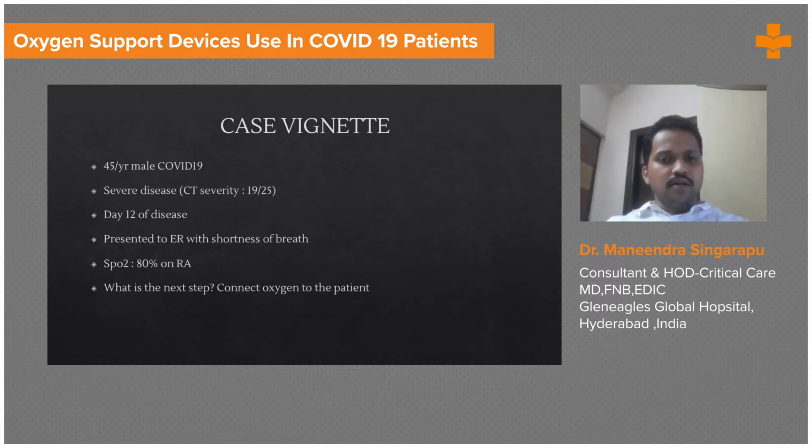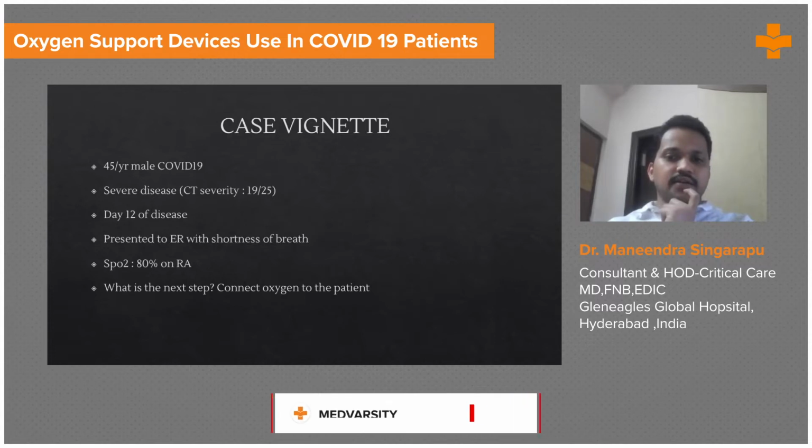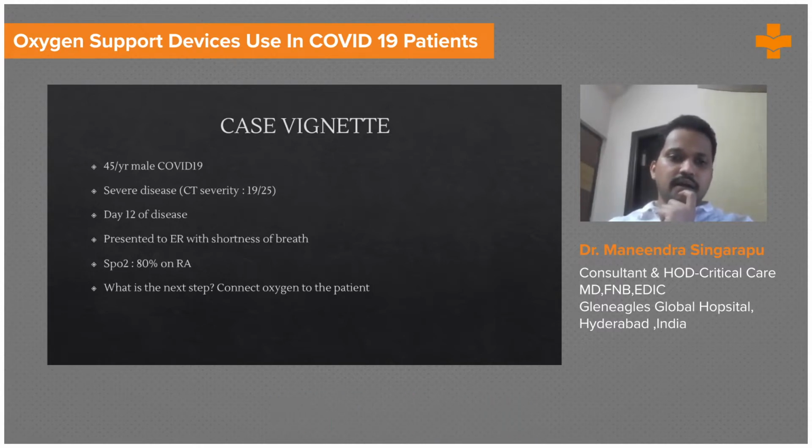So I'll be talking about two such interfaces. One is HFNC and the other is NIV. NIV here, in all my presentation, will be a portable NIV and not an NIV on the invasive ventilator. Even on the invasive ventilators, you can use them either in a non-invasive mode or an invasive mode. But here I am not going into invasive ventilators. Here I am restricting myself to portable NIV.